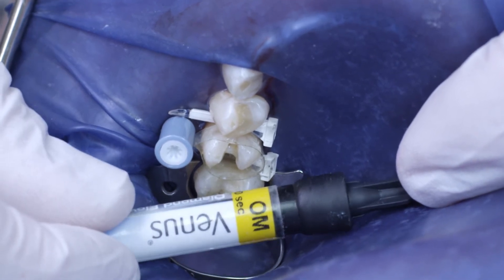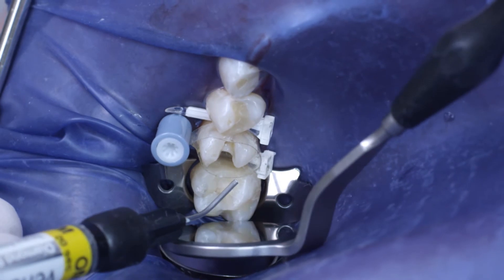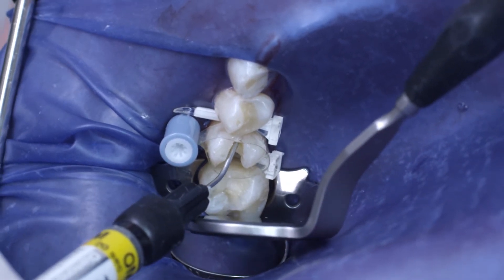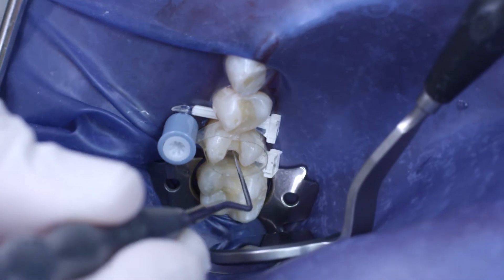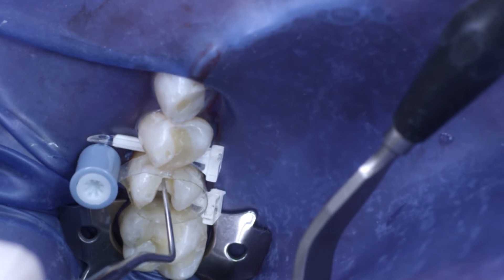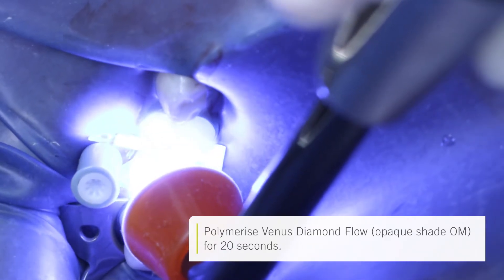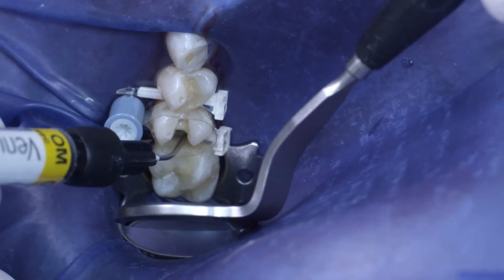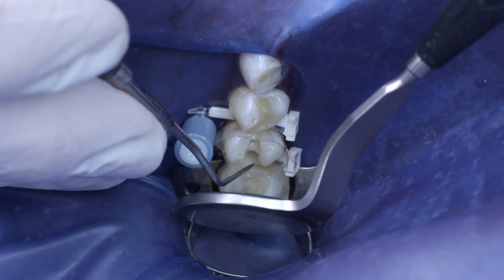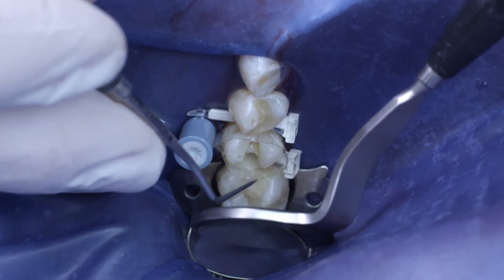To facilitate shade adaptation, Venus Diamond Flow in shade OM was placed in the cavity. The mesial tunnel area was also filled with this material. It is very easy to place in the cavity without causing bubbles. The same flow material was also used in the distal area to ensure perfect adaptation of the material to the matrix band.